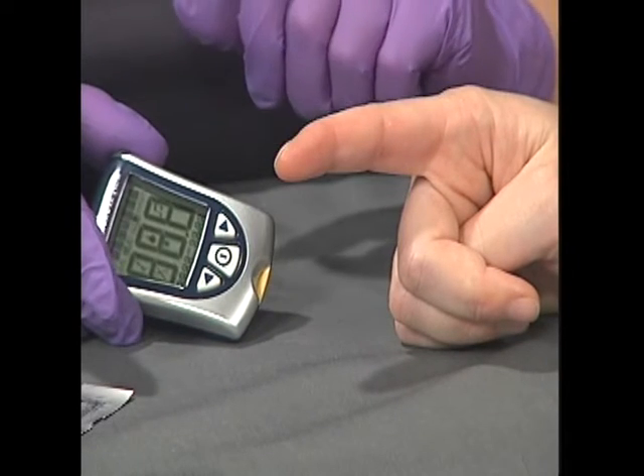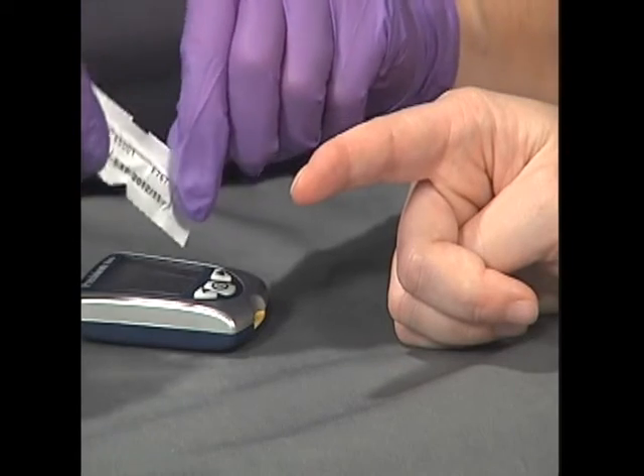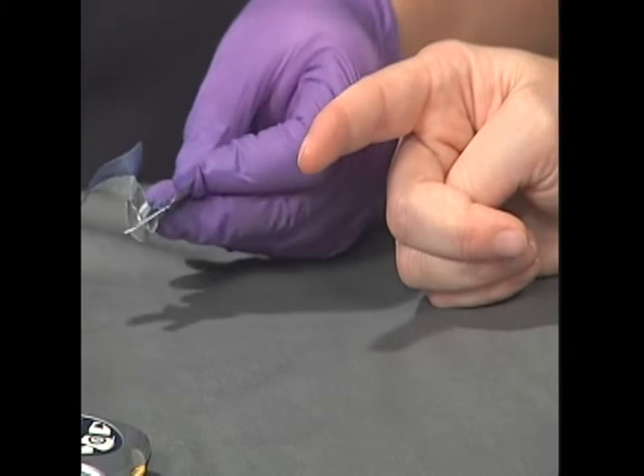Turn the unit on by following the manufacturer's directions, although some units may turn on by inserting a test strip alone. Confirm that the test strip code matches the display on the glucometer.